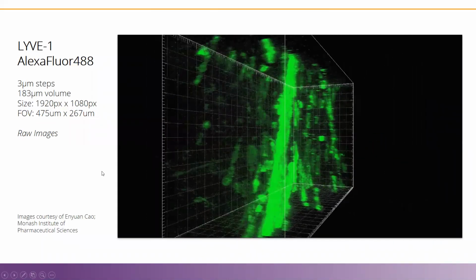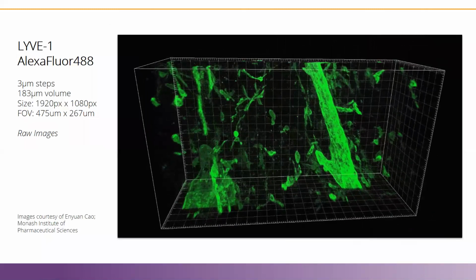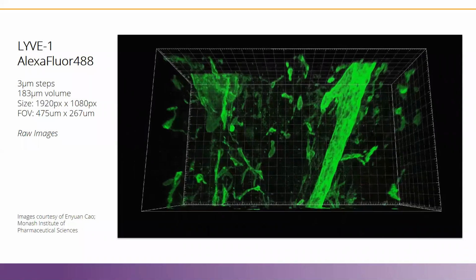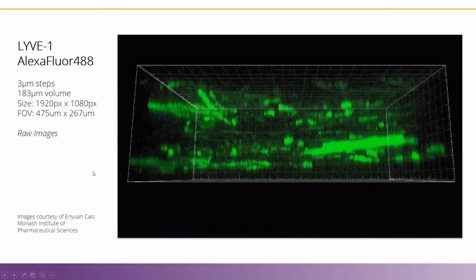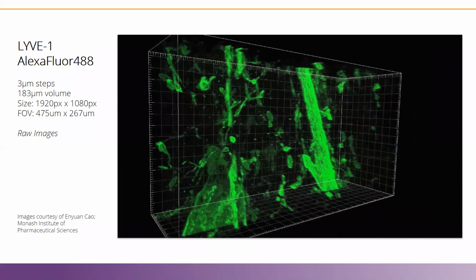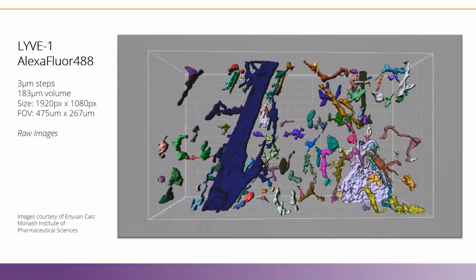So similarly, for your experiment, if you are working with blood vessels, or if you are working with kidney cells, or if you are working with any other tissue, you can basically capture such optical sections and organize them into functional videos like this. And from a publication point of view, you can submit them as supplementary data, but these things look really cool when you are going for a grand presentation, or you are publishing or you are presenting your ideas at a conference.